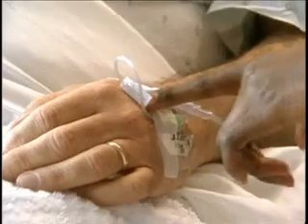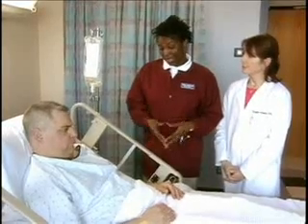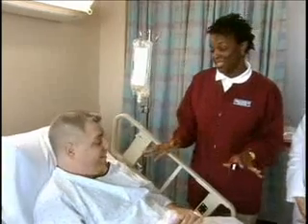Now, we just want to check the site for swelling, pain, coolness, and pallor. Why is that? Well, it could be a sign of fluid infiltration into the tissue around the IV catheter. Which doesn't sound good. It's not a good thing. We also look for redness, swelling, heat, or pain. That can indicate the development of phlebitis, which is an inflammation of the blood vessel at the site. You see, we talk the same confusing way to our clients. I'm sorry. I mean, everything looks good.